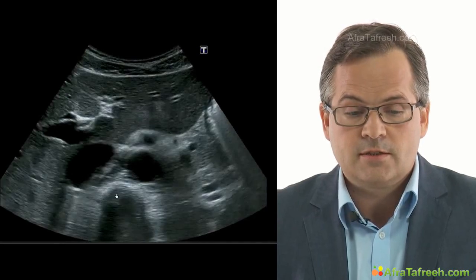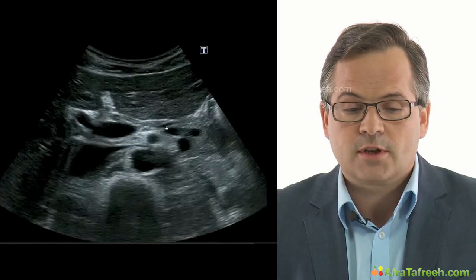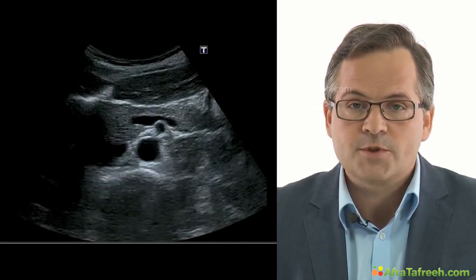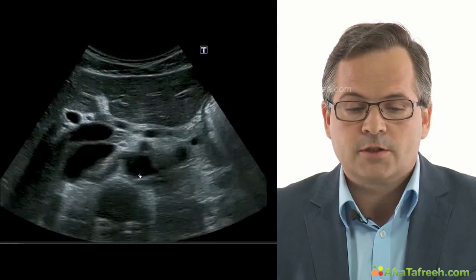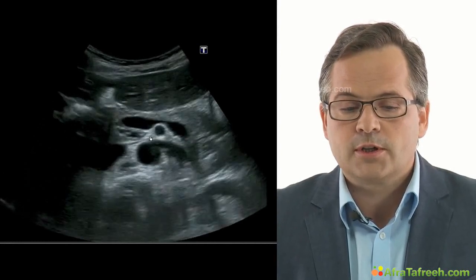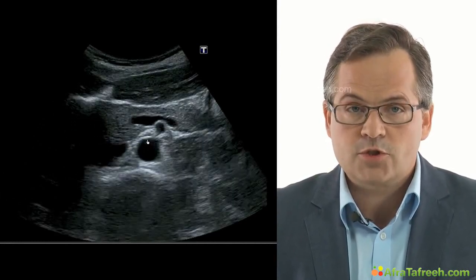Once again, aorta, splenic trunk, celiac trunk over here. Once again, the aorta over here, celiac trunk, and more caudally, superior mesenteric artery over here. Both round-shaped because we are scanning in a transverse view.